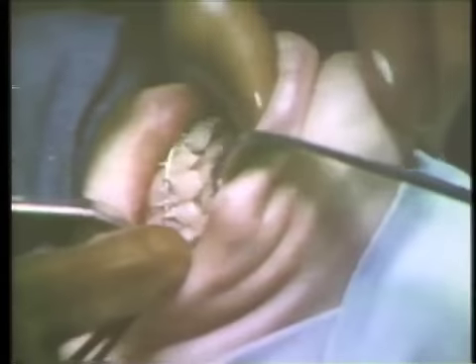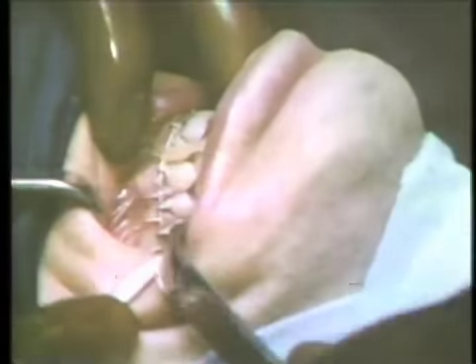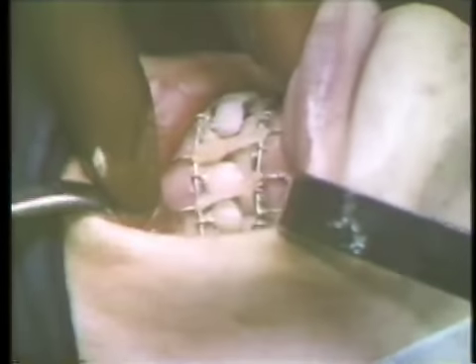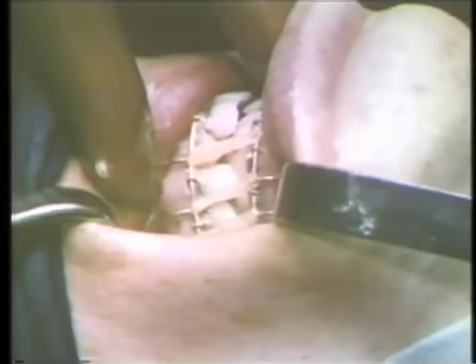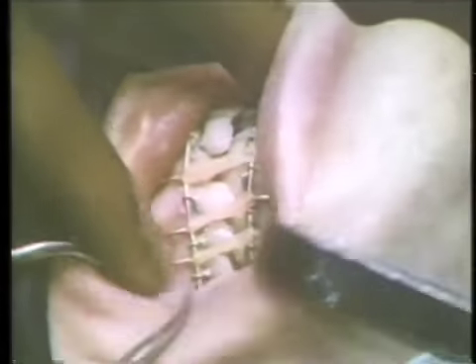The fragment will be held laterally, the operation carried out on the opposite side the same way before going into the mouth, and again adjusting the position of the mandible. That is done while the wounds are kept open, and the fragments are now overriding. The posterior fragment is lapped laterally, and it remains so and is held there during healing and remodeling. The functional occlusion is established.